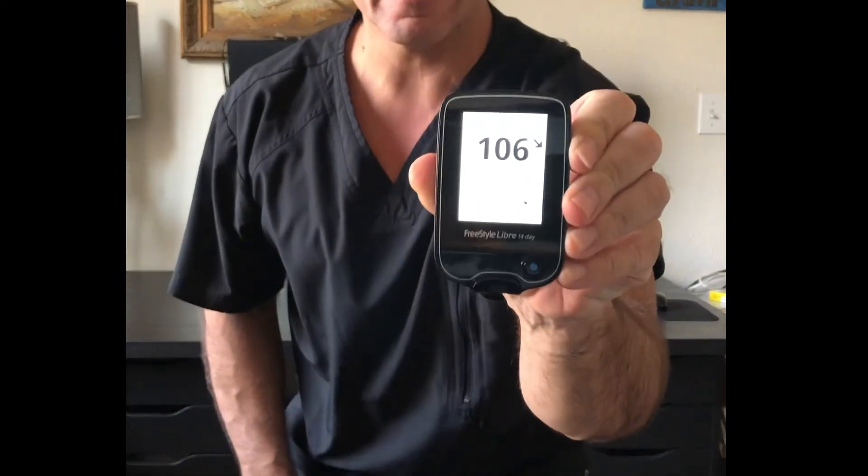We're back — it is later, like I said. I'm turning on my reader and I'm going to scan my arm. Had to check sugar first. It says 106. So 106 is my reading.